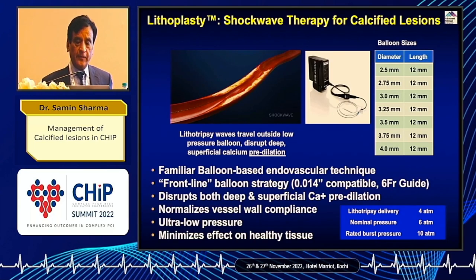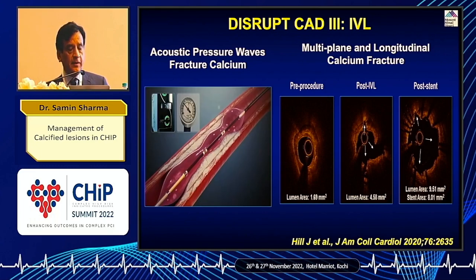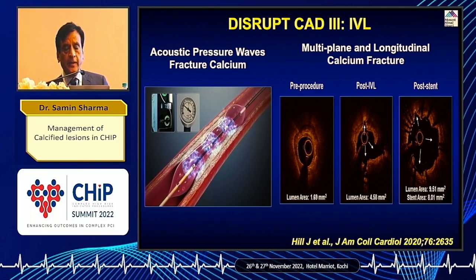Then of course we have a new kid on the block, which has become a favorite for most of us now because of ease of delivery: Shockwave. It's a simple balloon-based technique, and the technique is very rapid to learn. There is not much of a learning curve, and it is a very effective device. The deep cracks in the calcium have been shown by various imaging studies, OCT and IVUS.